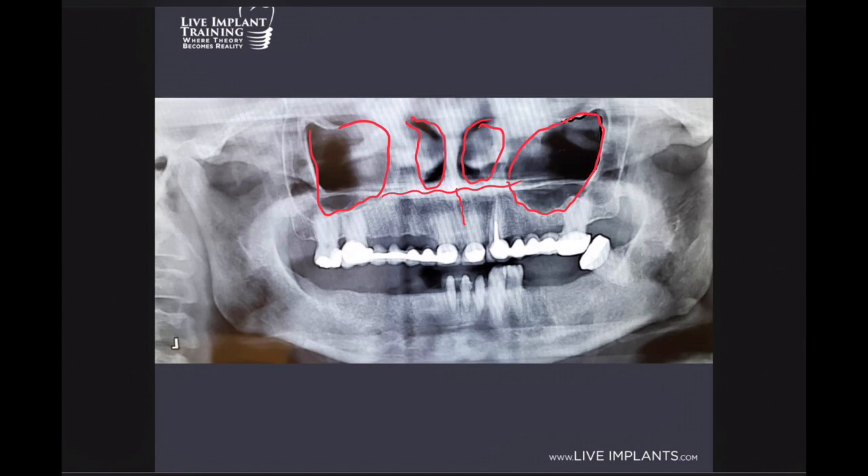Now we're going to highlight and trace the inferior alveolar nerve. We know this is going to come around the first or second premolar, and we're going to do the same thing on this side. It's kind of hard to see over here on this side.